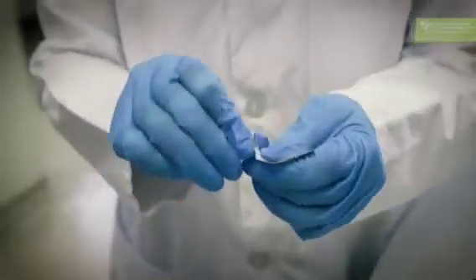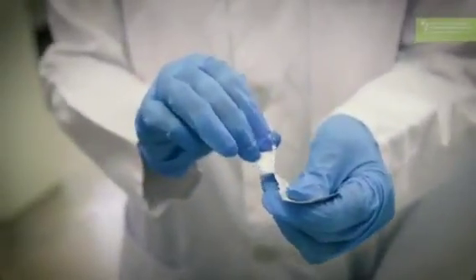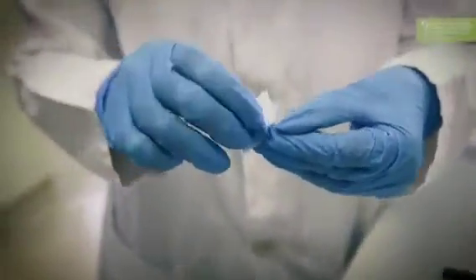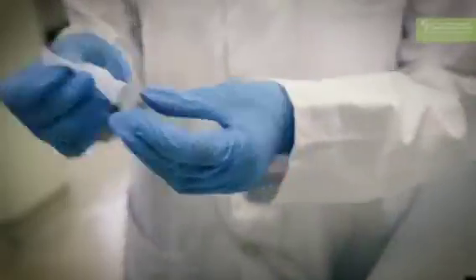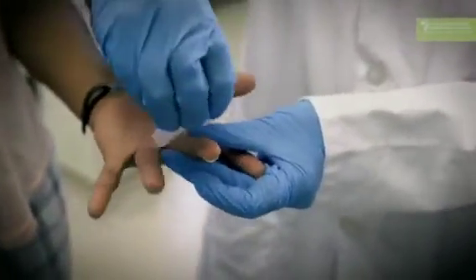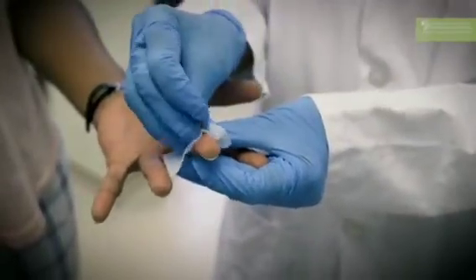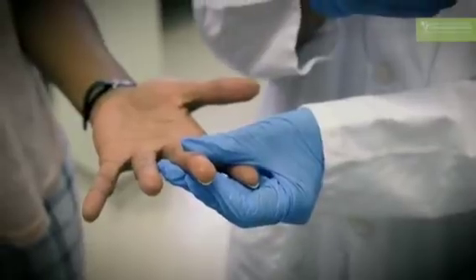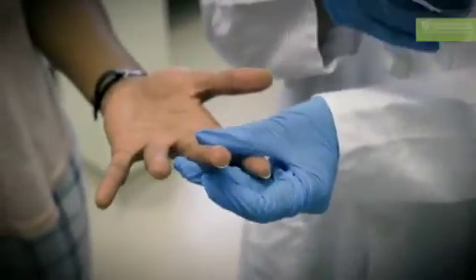Once you have selected the finger, you need to clean the finger. You use the alcohol swab to clean the finger. So you need to first tear open the alcohol swab. You get the hand, and you're going to move from mid finger in one swoop over to the fingertip to make sure that you have cleaned the finger. You let the finger dry, and then you are ready to start the test and get the lancet ready.